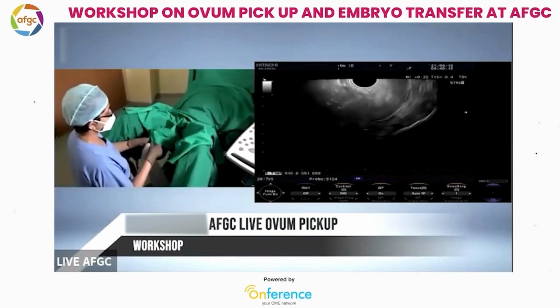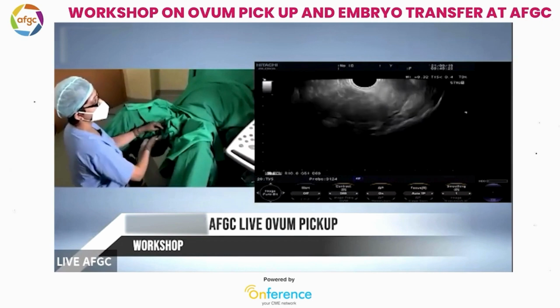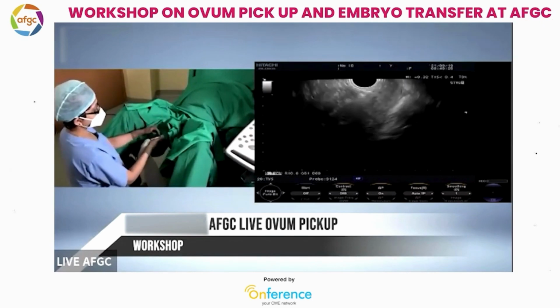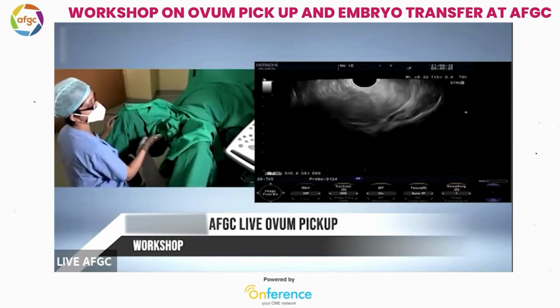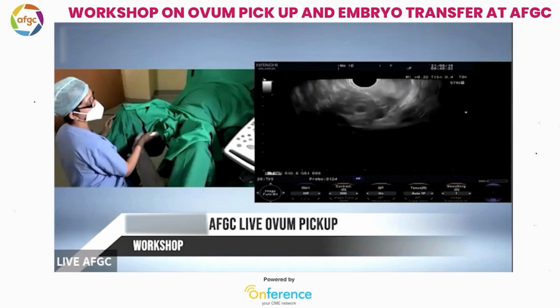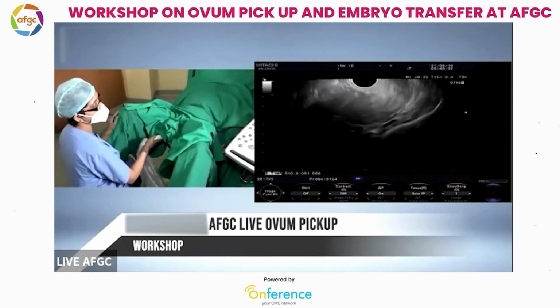We have adjusted the brightness and the depth. If you see, this marker is on the top, and when it is at the top, we are getting a full sagittal view. I am going right and left to see the thickness of the plane in which I will measure the thickness.